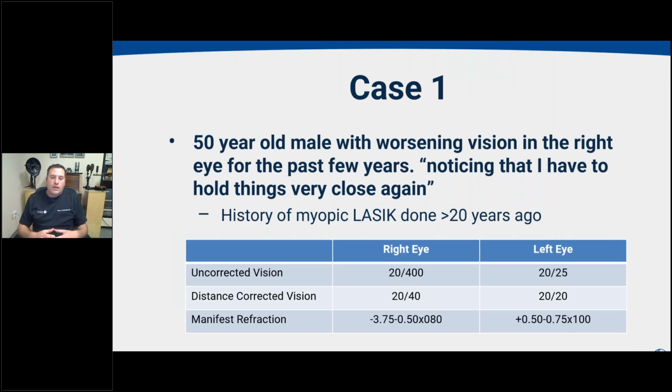So that shows in general how we use the AXL wave from a cataract point of view, particularly focusing on the full sequence overview. With the remaining time that we have, I want to dive into a few different cases to explore how we use the AXL wave to help us navigate through some of the more complex cases, but also some of the cases that we see all the time in our clinics, and really honing in on some of the other maps that you can dive into even further to help us with our diagnosis and our treatment plans.